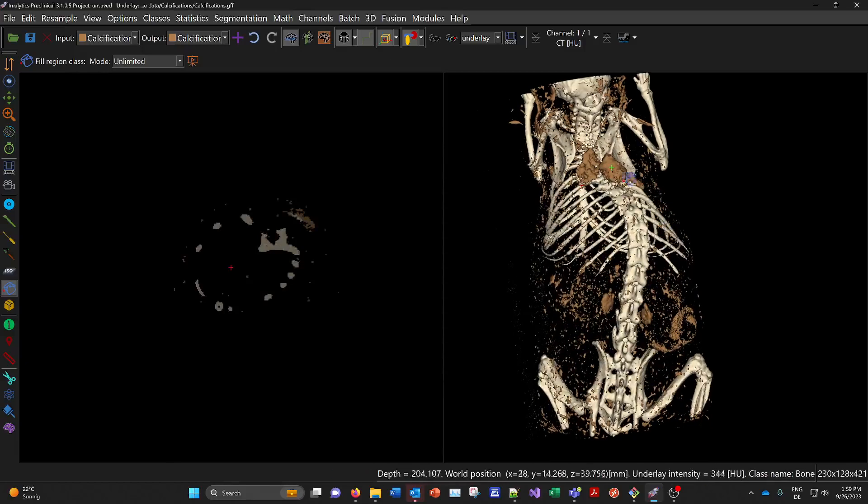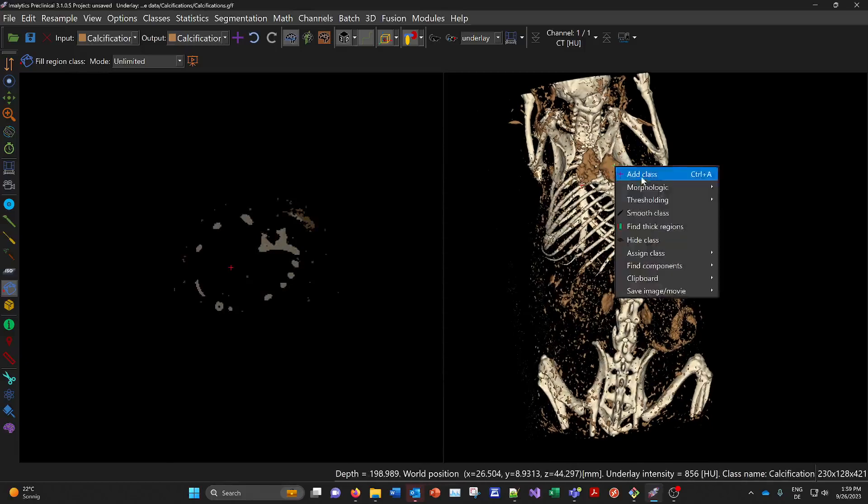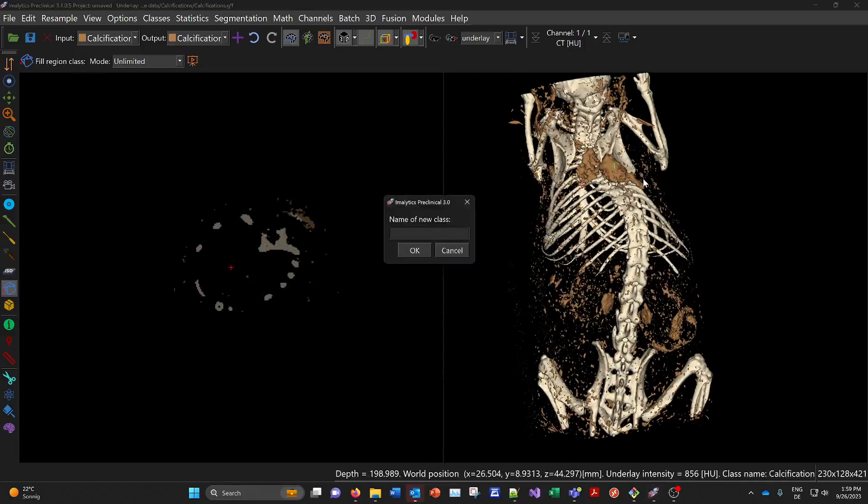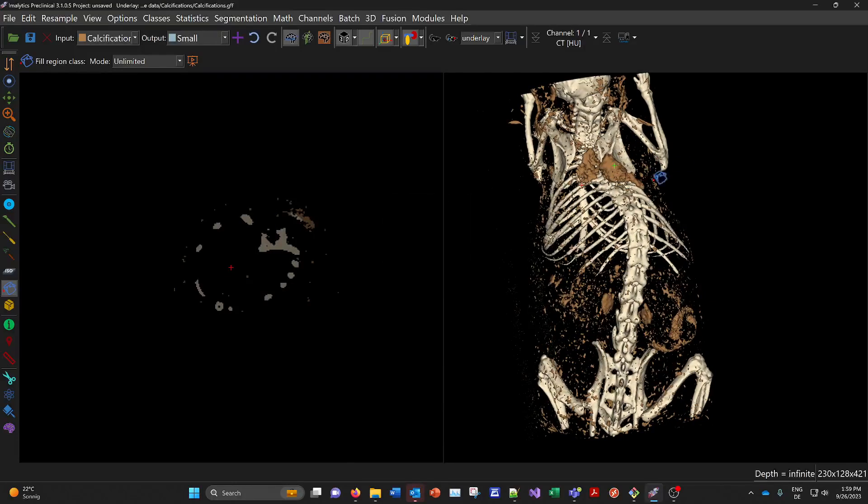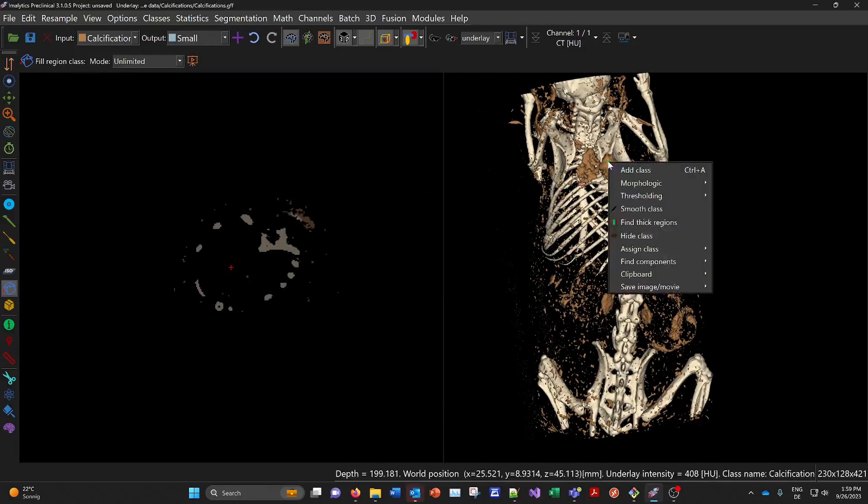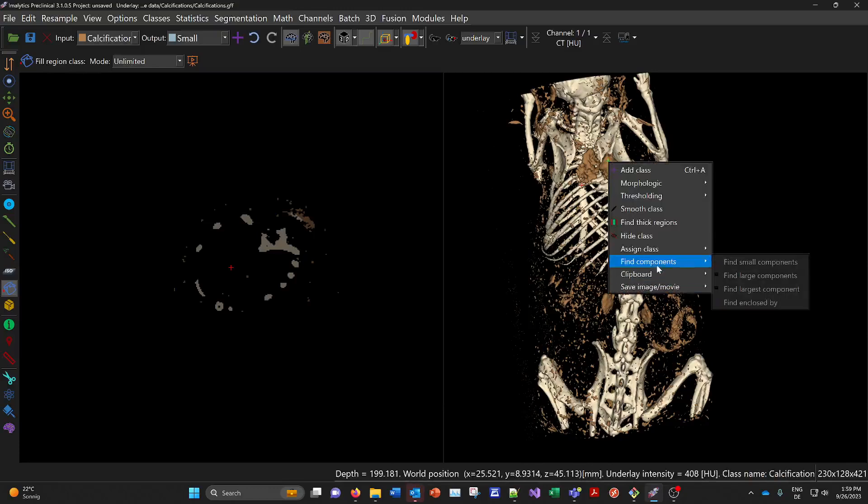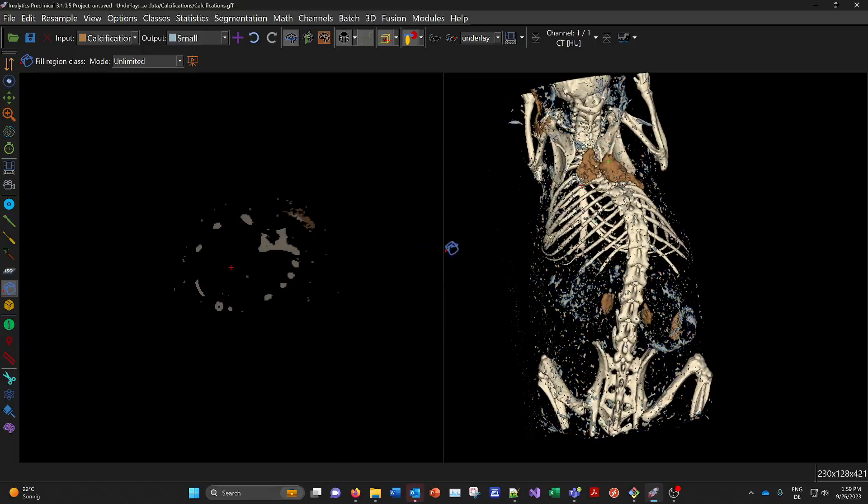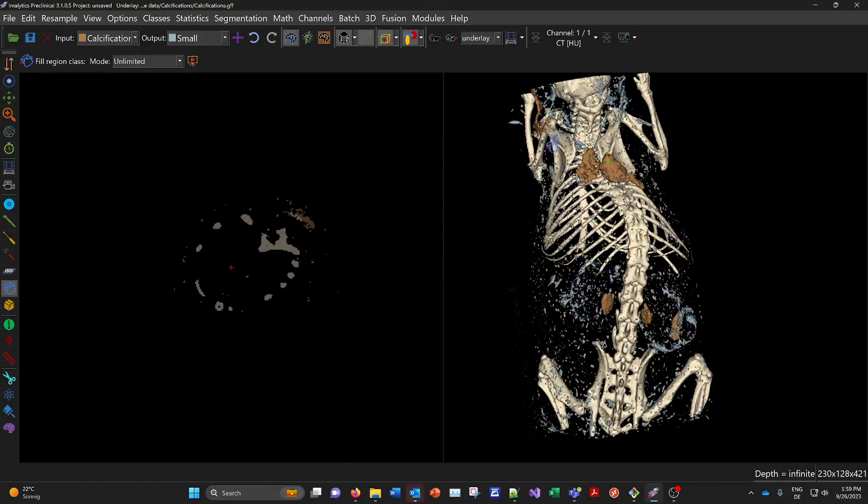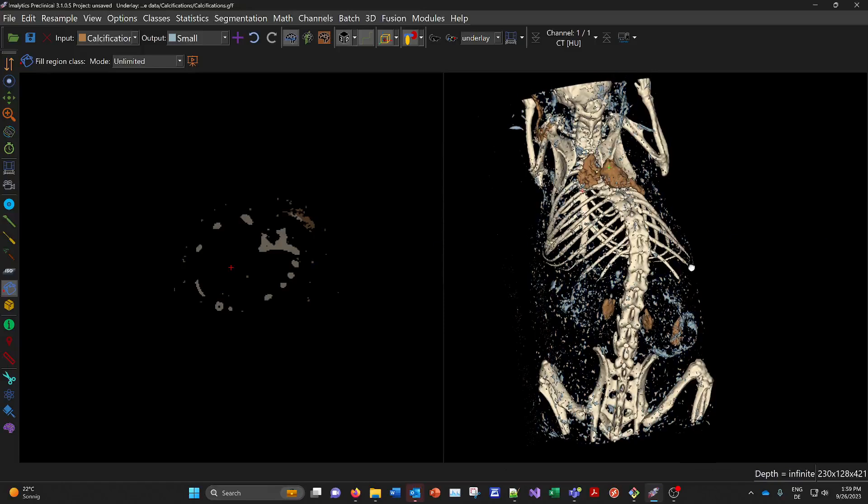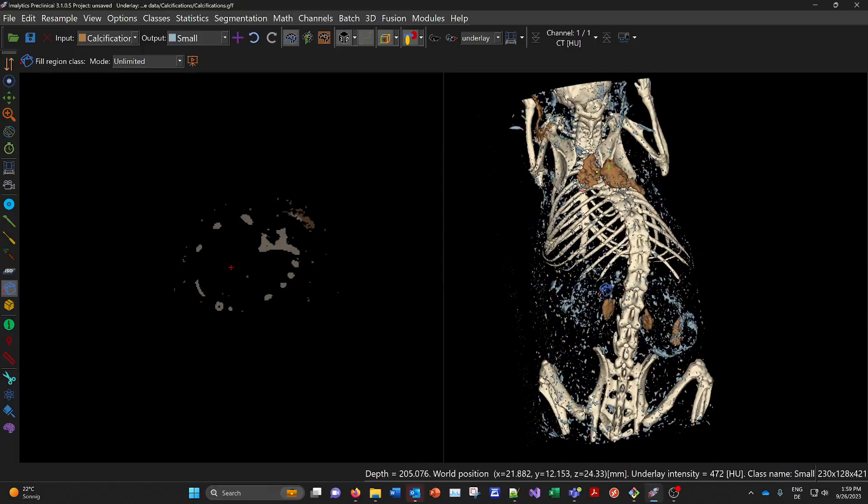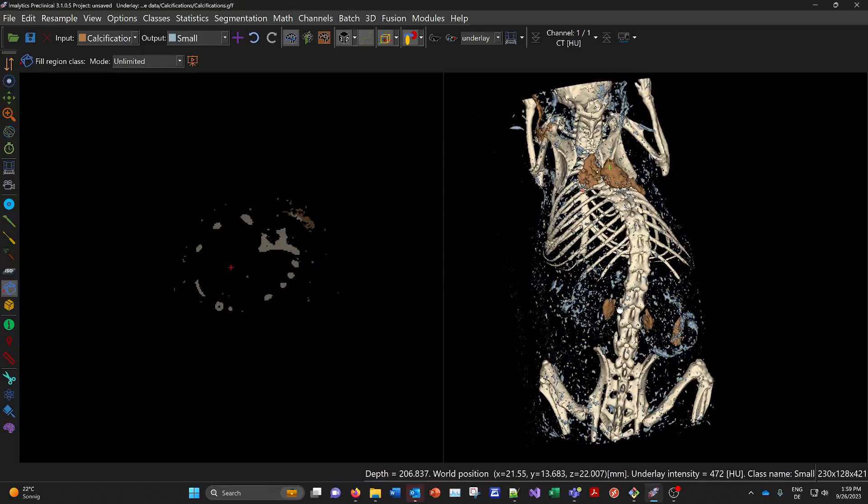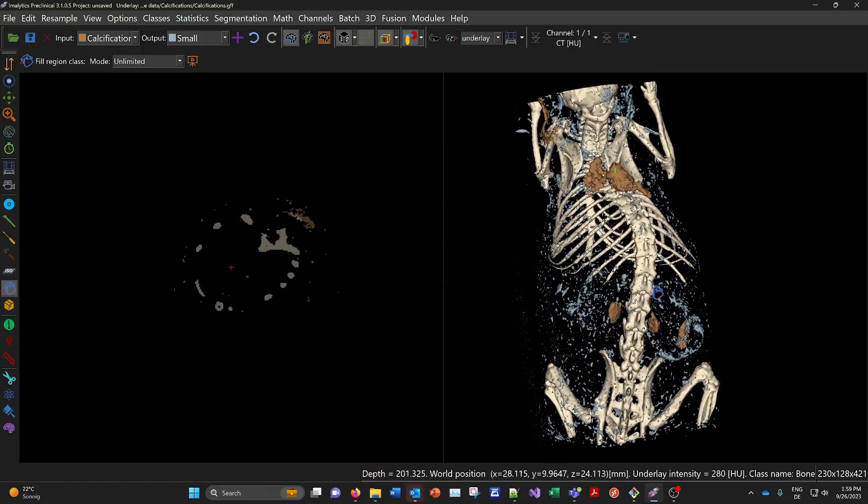And you can also use another tool. Like you could make the small guys. Make the class small. And classify them by size. For example here with find components. Find small components. Everything under maybe five cubic millimeters. Assign them to another class. And then this way you can kind of categorize your calcifications.